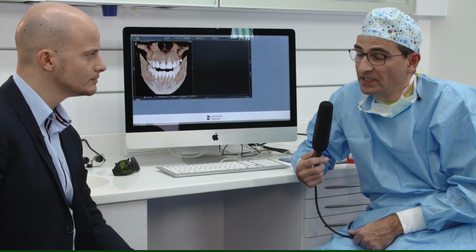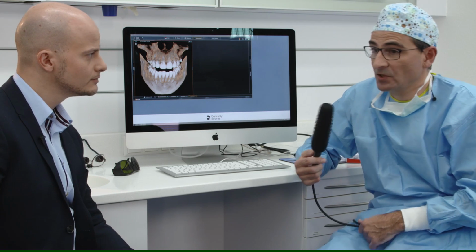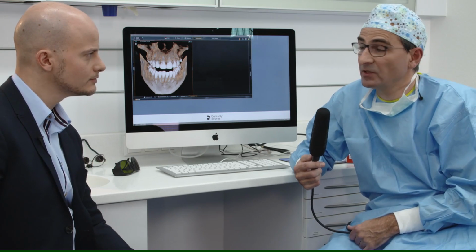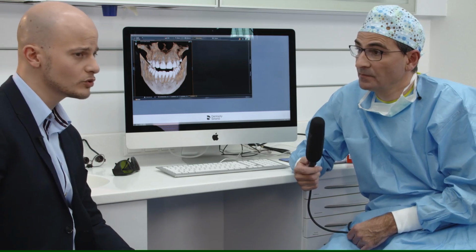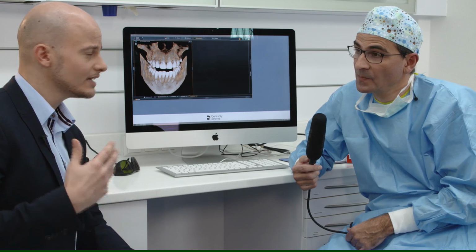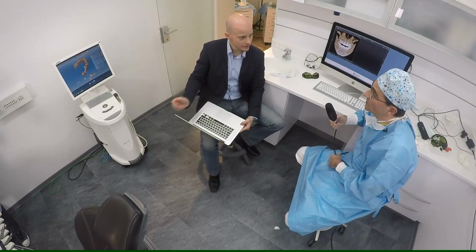And as you could see, we delegate this to our assistants, so it's not the job of the dentist anymore. It's coming more and more that you have special assistants for the CEREC work. That's always good when you have the possibility to delegate things, because in this time you can do other things, for example. For sure.